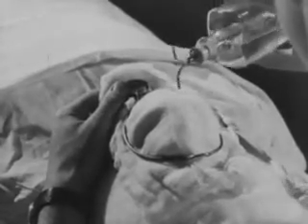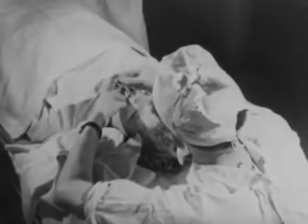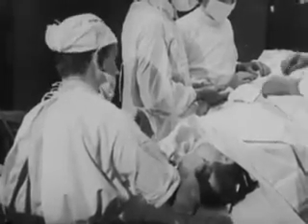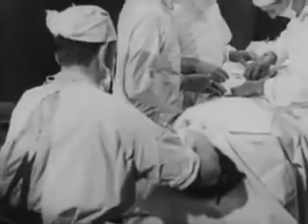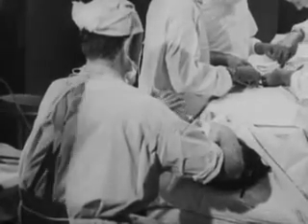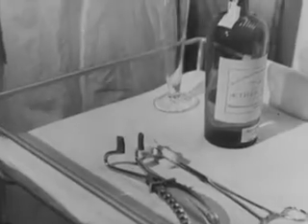Start slowly, but speed up the flow of ether as steadily as you can. Use an artificial airway if you think it'll help at all. Be sure that the patient is deep enough before the surgeon starts. Until you've gained experience, keep the patient deep rather than light. Deep anesthesia doesn't seem to be as important a factor in causing post-operative vomiting, as is an obstructed airway with cyanosis, carbon dioxide accumulation, and excessive salivation. And finally, don't forget that ether is highly inflammable and even explosive when mixed with oxygen.